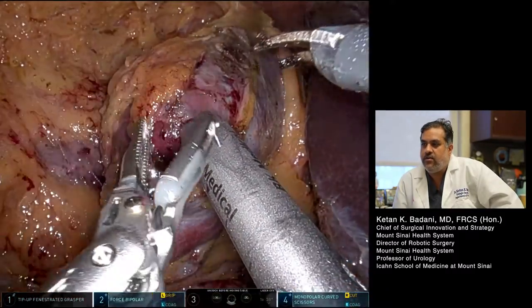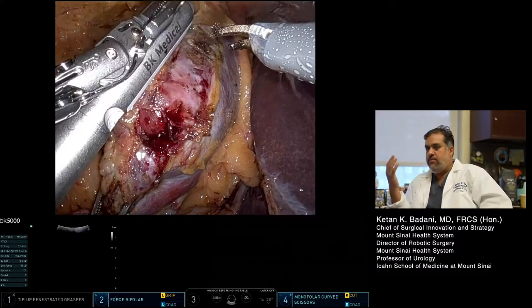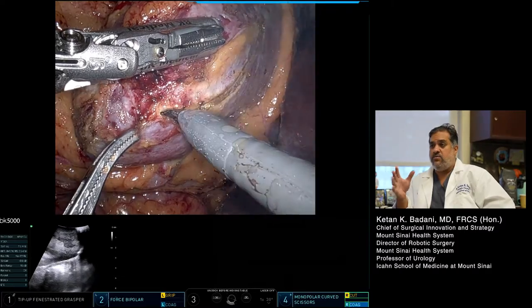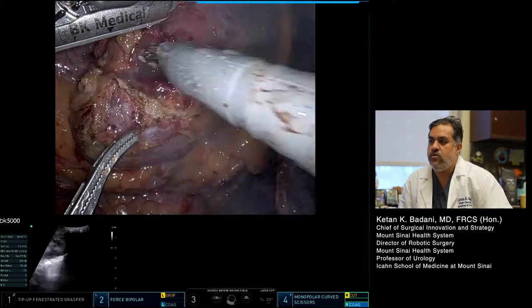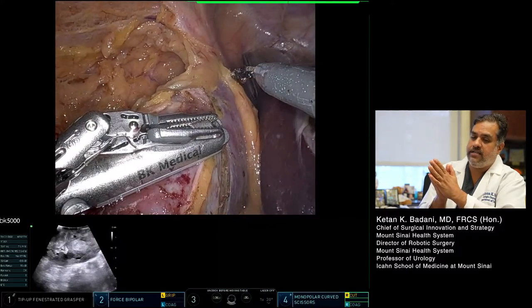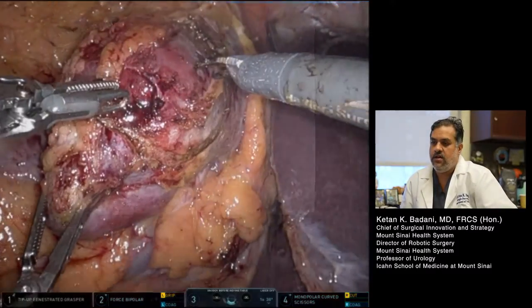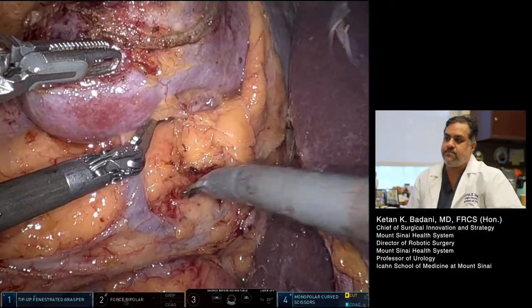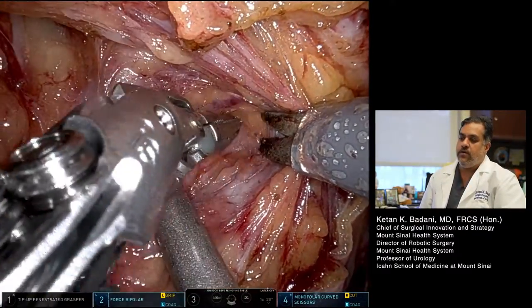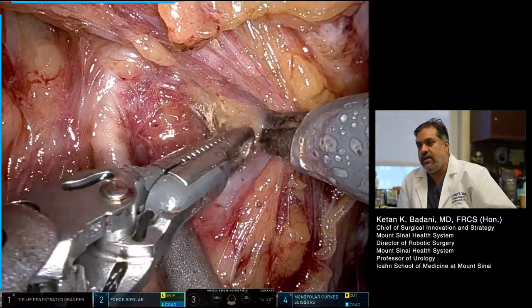Now we have the entire lower pole — posteriorly and anteriorly — exposed. Now we're going to do something extremely important: intraoperative ultrasound. Intraoperative ultrasound is one of the most important things you do during partial nephrectomy — it's really the only time you truly learn how to get good at it. You really have to take your time and mark out where this tumor is. On an endophytic tumor you must make sure you're marking at the correct angles; if you see it on ultrasound but aren't at the point closest to the surface, you can completely miss these endophytic tumors. I really do spend a reasonable amount of time on intraoperative ultrasound in complicated situations.